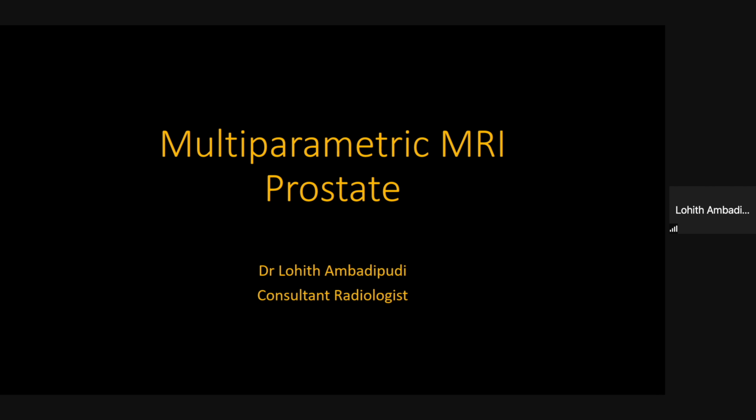So I understand most of the audience members are urology trainees or urologists, and I'm not expecting radiologists here, maybe a few. So this talk is going to be quite basic, and we'll go through lots of sample cases and how it helps in surgical planning.